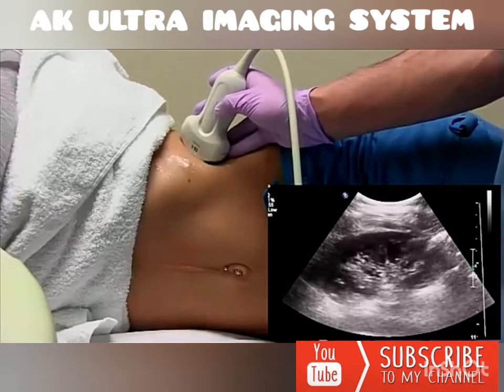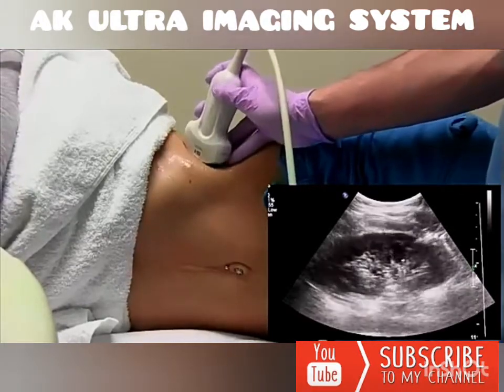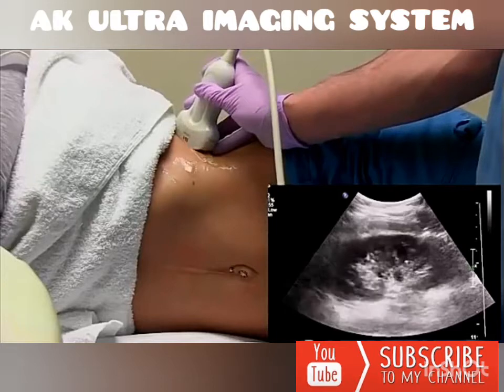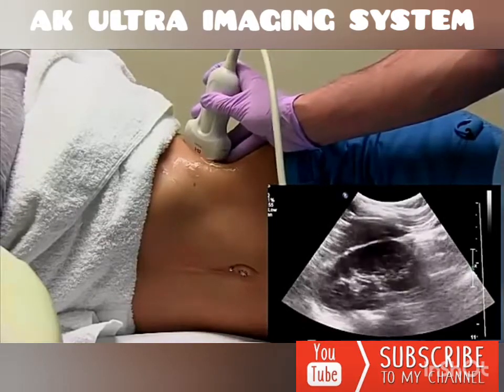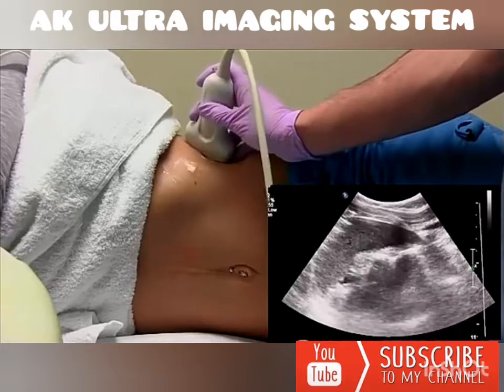The lower pole is going to be more anterior. So you're going to have this oblique transducer position. And when you get the kidney, you probably will also see the spleen in this window as well. And you just want to make sure again that you're sweeping through the kidney in its entirety, lateral to medial.